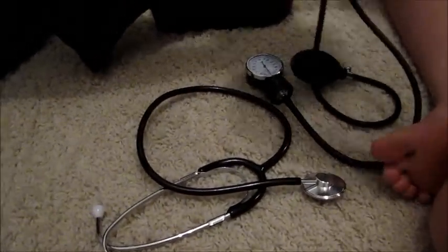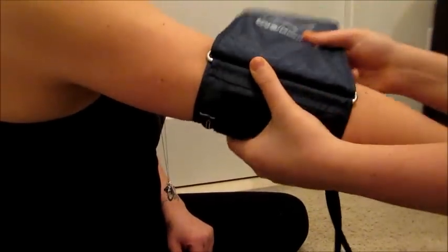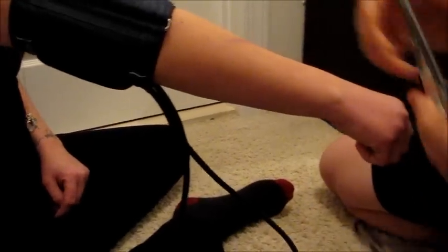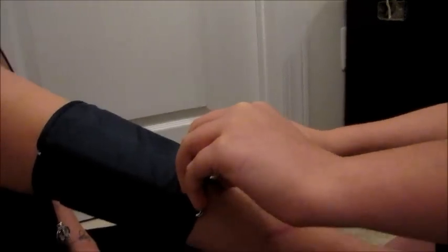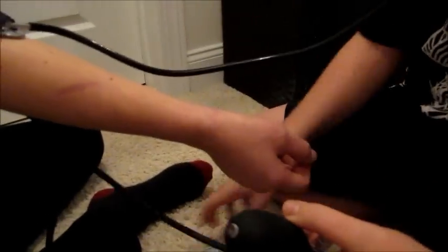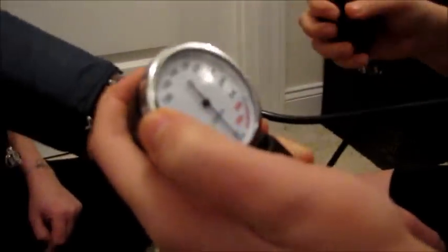First, I'll be attaching the cuff to the person's arm, then I'll get my stethoscope, put it in my ears, then I'll be putting it in the cuff a bit to listen to the heartbeat, then I pump the gauge to 160.